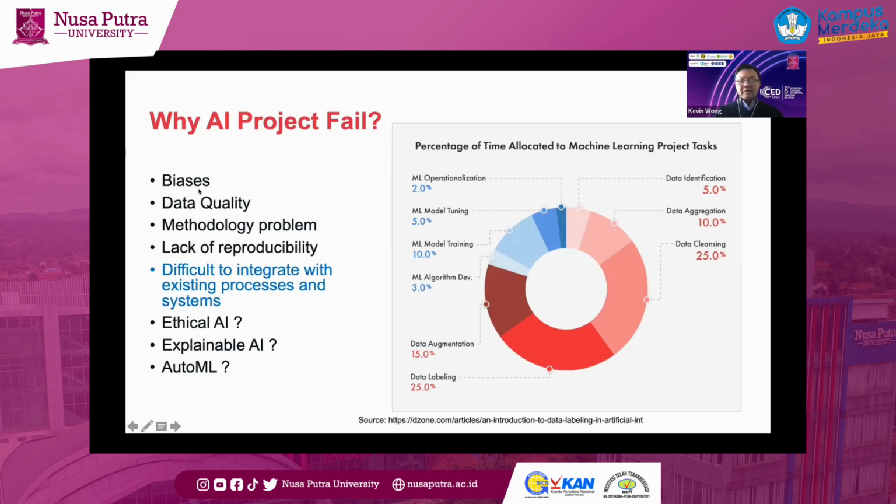What we understand today is that it's very difficult to build a deep learning model that can predict all types of cancer in one. All right, for example, we work a lot with the pathologists on identifying lymphoma cancer. So the model will be concentrating on lymphoma cancer. And lymphoma cancer, according to them, is one of the difficult problems they're looking at. In fact, we just started a project with them to look at prostate cancer. So for prostate cancer, again, we need to collect the data and so on. So that is one of the things we look at. And of course, the fourth point here is lack of reproducibility. A lot of the time you realize that deep learning has been used, but it's very difficult for the practitioners or humans to actually reproduce the results.